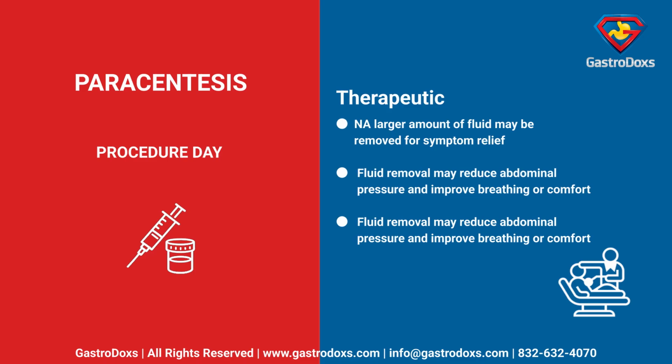Therapeutic. A larger amount of fluid may be removed for symptom relief. Fluid removal may reduce abdominal pressure and improve breathing or comfort. Albumin may be given if a large amount of fluid is removed.